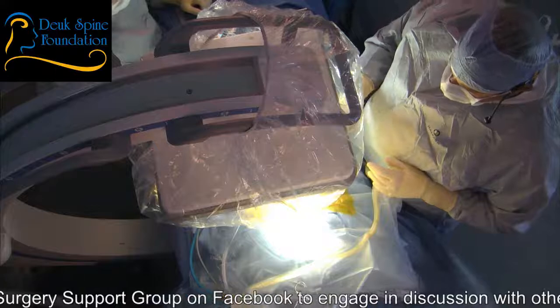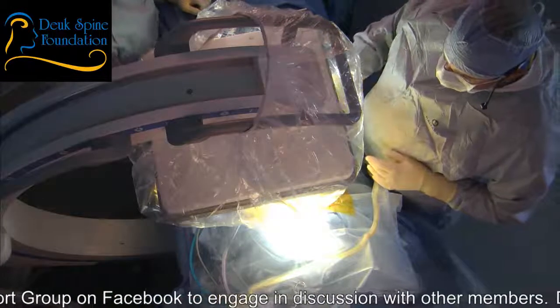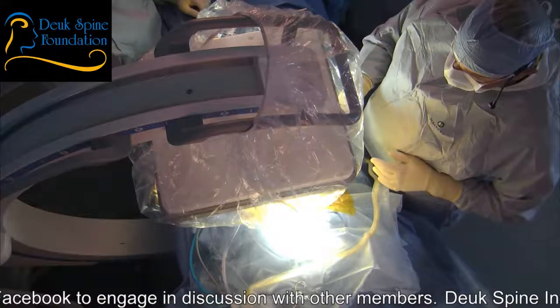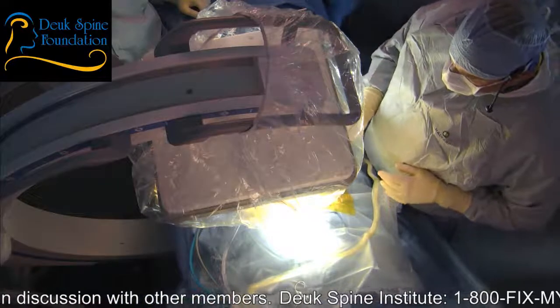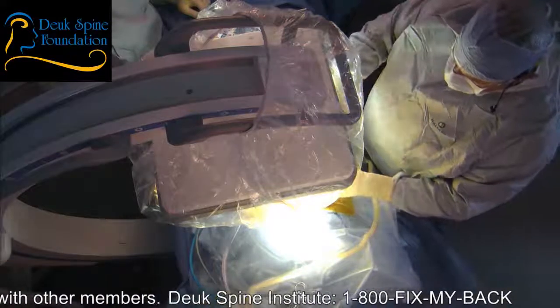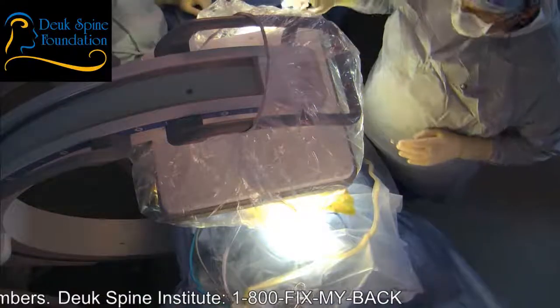Now, during the surgery, I'll be talking to my team, okay? And I'll be talking to you as well. Sometimes I'll be talking to our audience. So just be patient. And if you're having any pain, just say, ouch, and I will take care of it for you, okay? Right now, I'm just giving you some numbing medicine under your skin. 4 cc's.